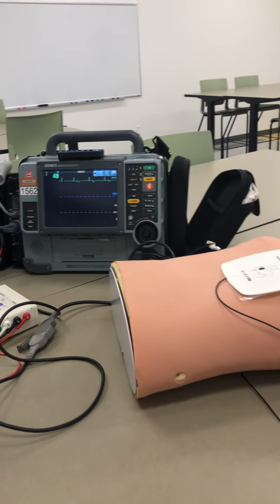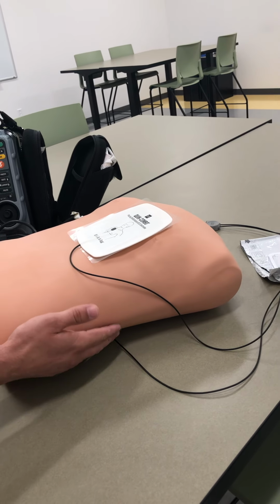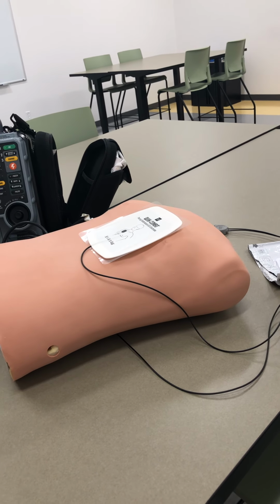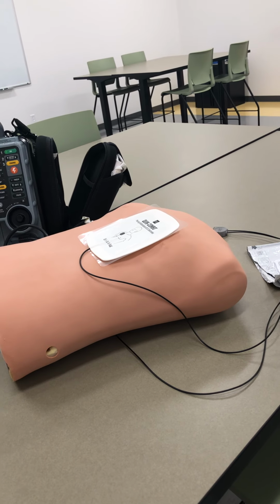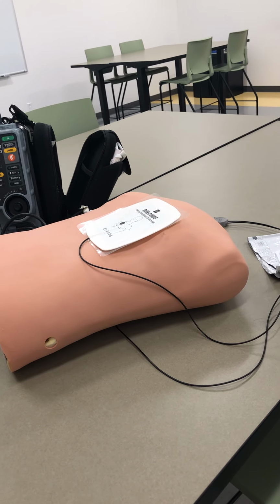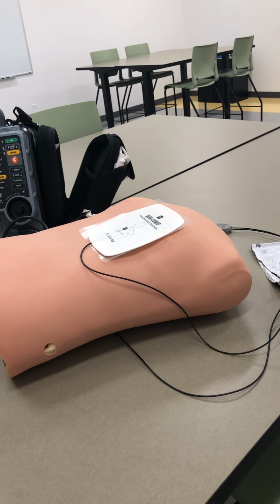First, we're going to apply the pacing defibrillator pads. You want to go with the anterior, posterior placement of the pads. The reason for placing the pads in the anterior and posterior position is because it minimizes transthoracic electrical impedance by sandwiching the heart in between the two pads.